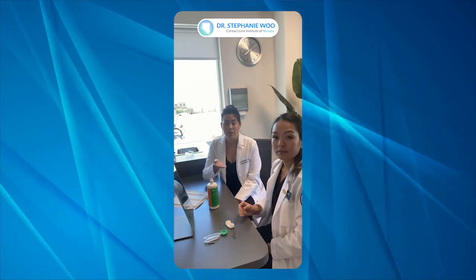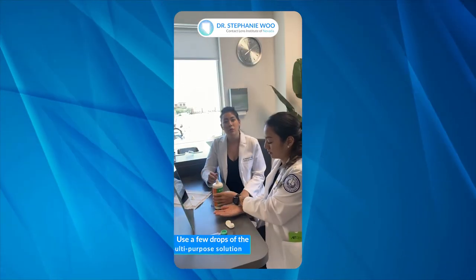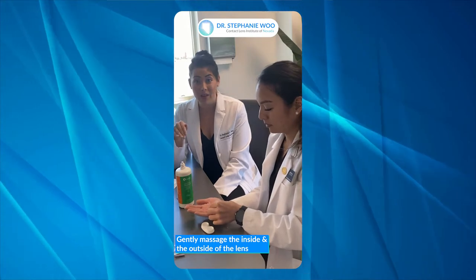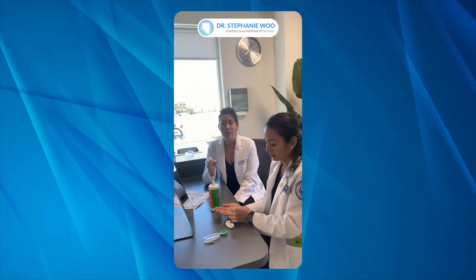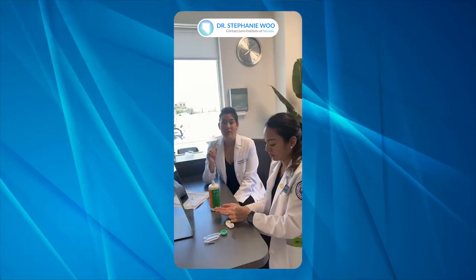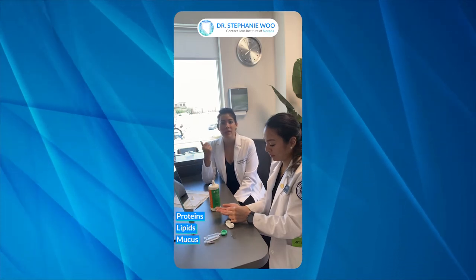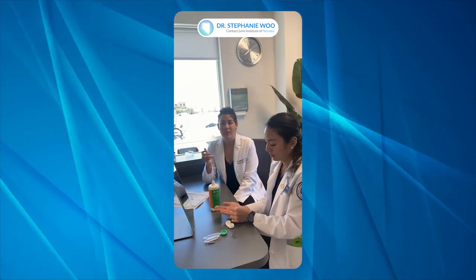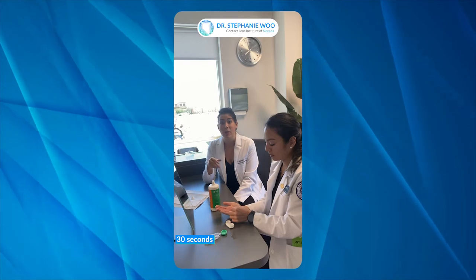Judy has removed her scleral lens and she's going to place it into the palm of her hand. Then she's going to use a few drops of the multipurpose solution and gently massage the inside and the outside of the lens. This is a very important step when cleaning your scleral lenses. You want to rub the lens with solution to break down heavy deposits — proteins, lipids, mucus, and other things that adhere to the lens surface throughout the day. Do that for about 30 seconds, rubbing both sides.